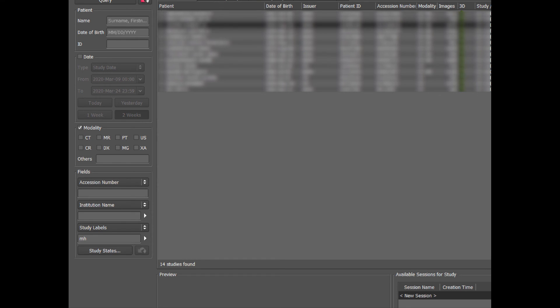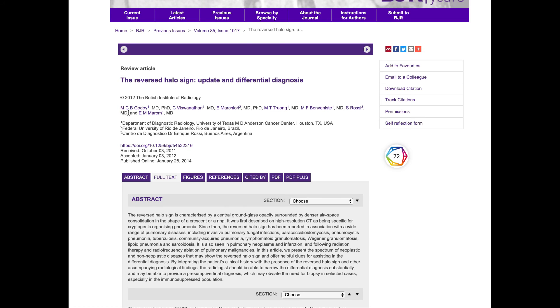There are certainly other entities that can cause the reverse halo sign, as reviewed in a paper by Dr. Marom and colleagues. But to emphasize the three most important ones: inflammatory etiologies — particularly organizing pneumonia — pulmonary infarcts, and infections. If you have a neutropenic patient, always consider the diagnosis of mucormycosis when you see the reverse halo sign.